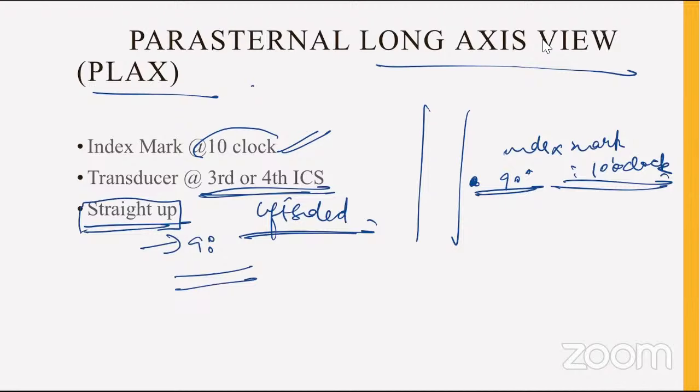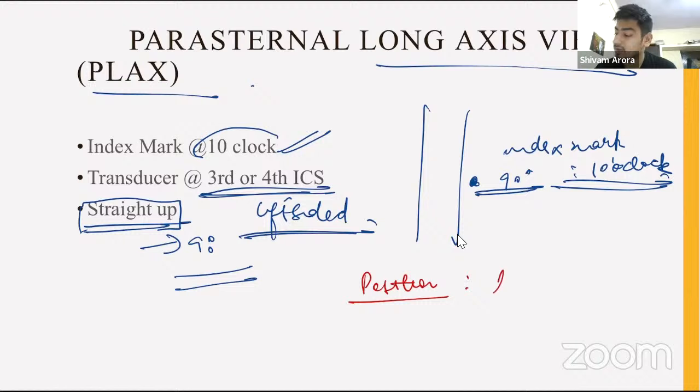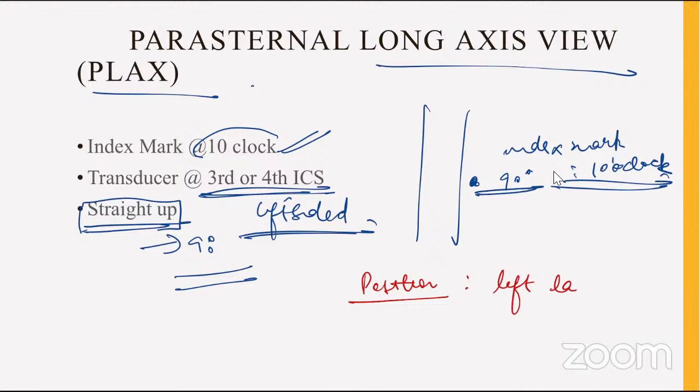Another important thing is the position of the patient while doing a 2D echography, which is left lateral. Clear?